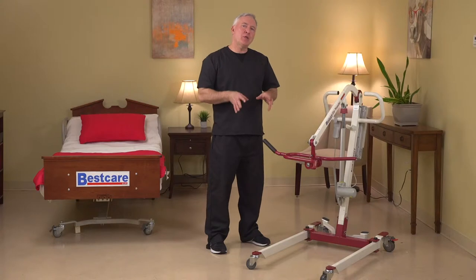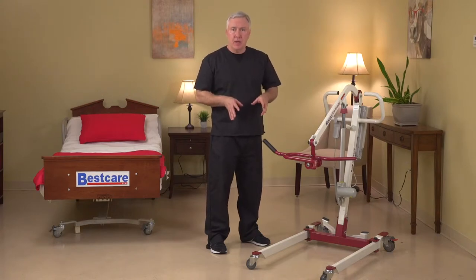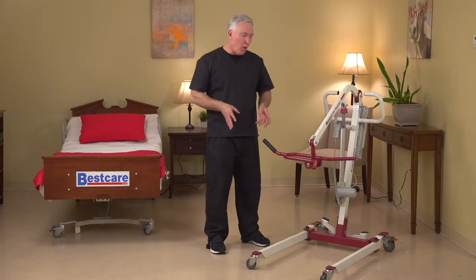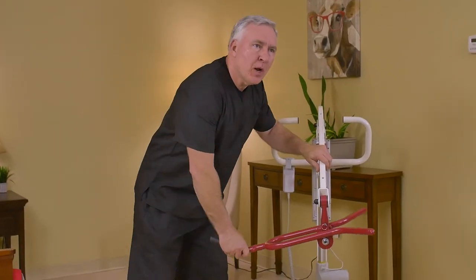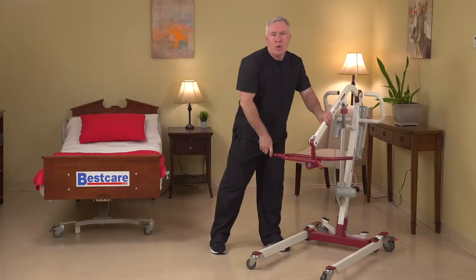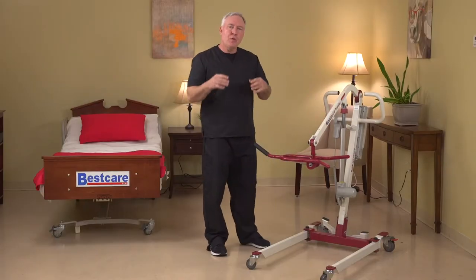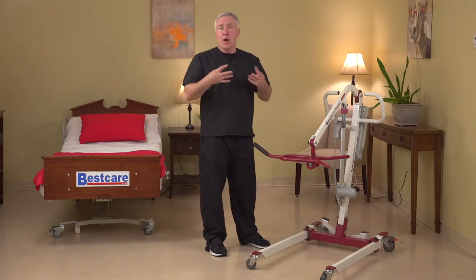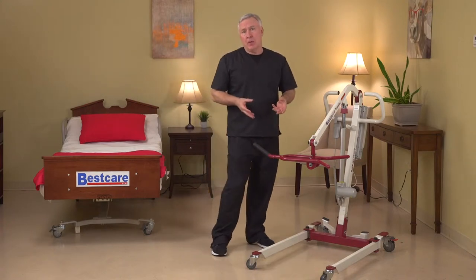Now it's time to show you the specialty lift we're calling the PL 350 CT. We're very excited to bring this product to the market because it is the first time we're incorporating a rotating spreader bar into our product line. In a few minutes I'm going to demonstrate how the sling works with this specialty spreader bar, but we already know that this product is designed to get people in and out of a car very easily.